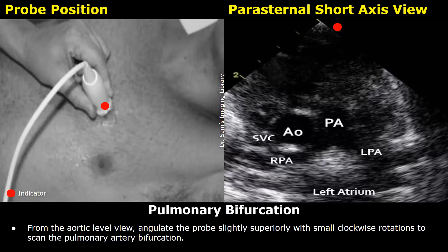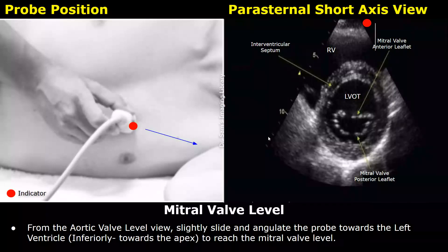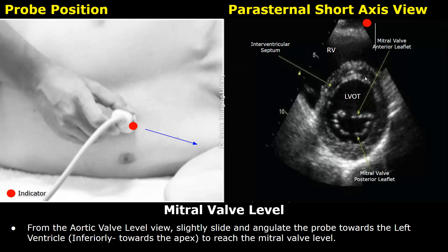To reach the mitral valve level, slightly slide and angulate the probe downwards towards the left ventricle apex from the aortic valve level view. The right ventricle appears at the top of the image, then the echogenic interventricular septum, then the left ventricular outflow tract where we see the mitral valve leaflets. The anterior leaflet of the mitral valve is seen above the posterior valve leaflet.